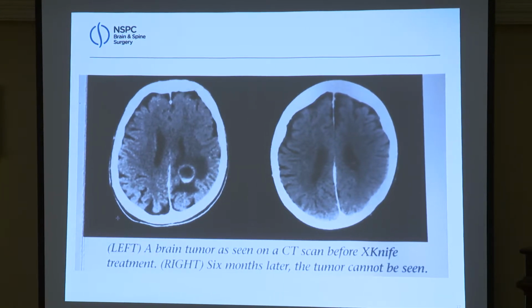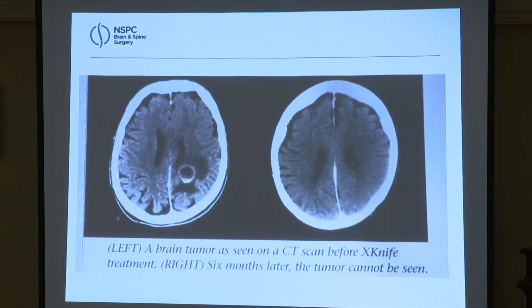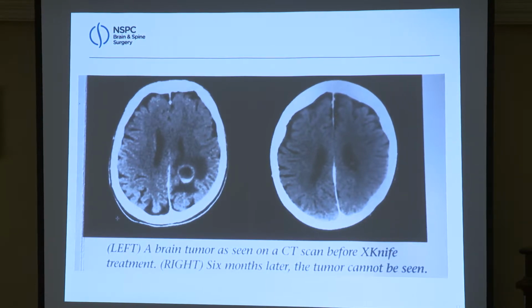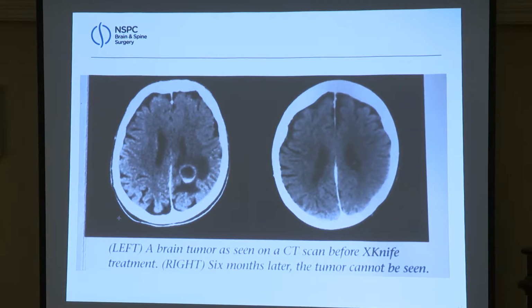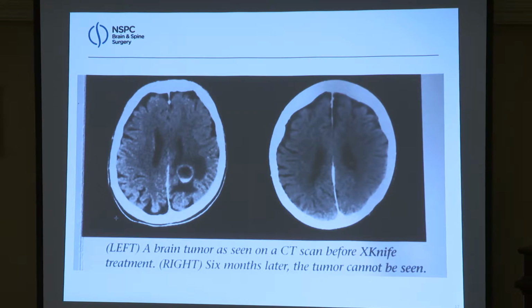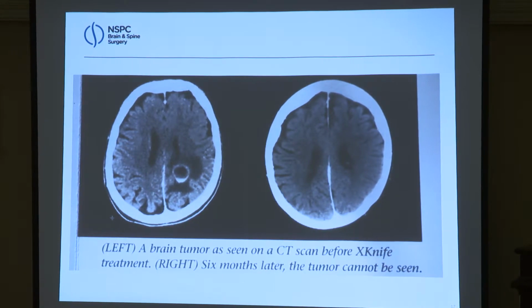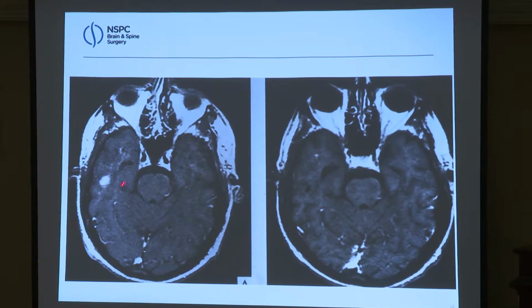One of the key things, I think, with doing successful brain radiosurgery for the brain mets is getting them in immediately, because if you wait on this a month, this thing is now 3 times the size, and to then say, well, it didn't do well, of course, because you waited too long. So the timing is important. On malignant disease, I like to get them in ASAP. I would just put this person on Decadron, get them in 2 weeks later and do it, and they'll probably do very well. This is a person, not my case, but this is a melanoma metastasis.